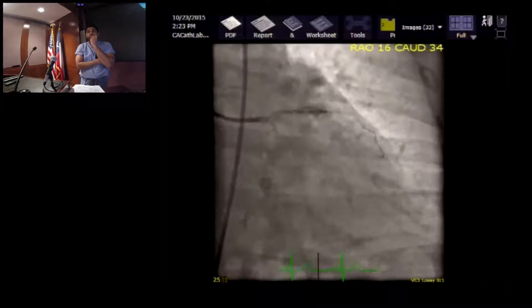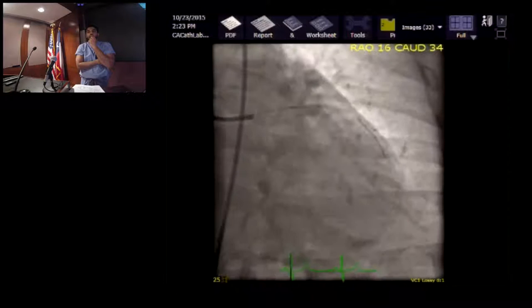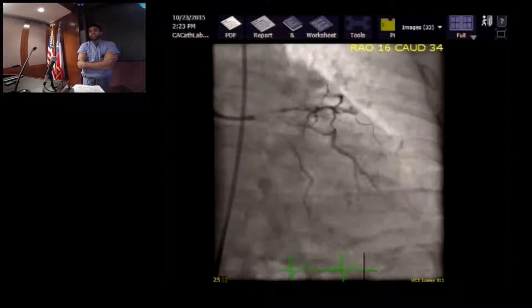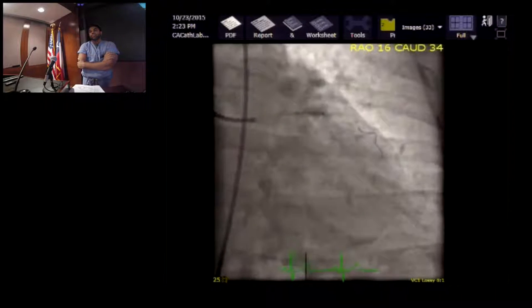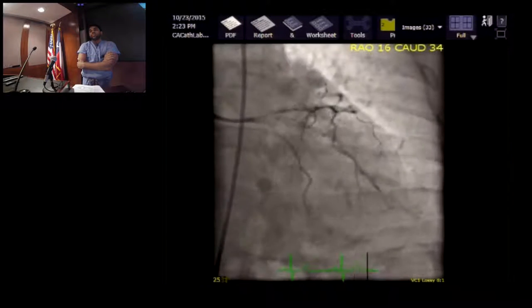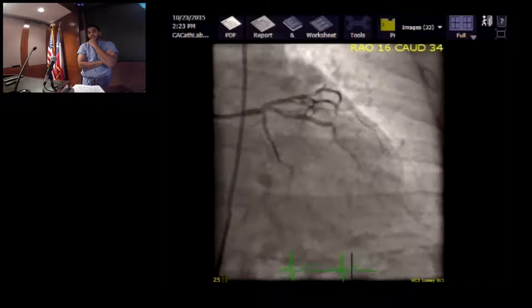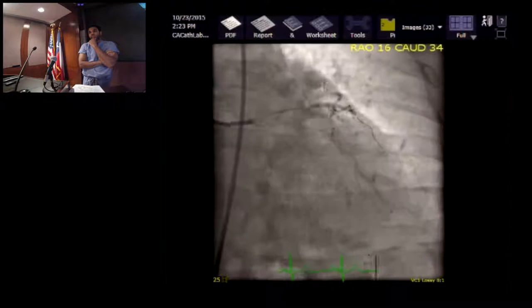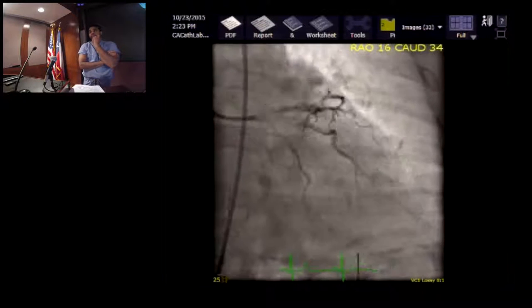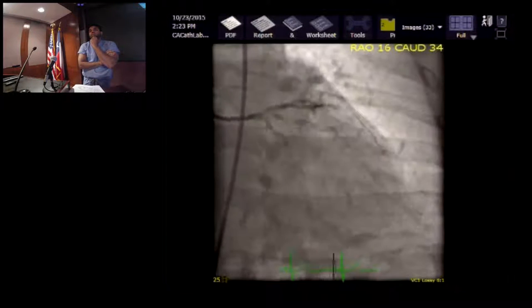Yeah, so we actually did that. Unfortunately, we didn't spend enough time doing a washout of the adenosine infusion. What Josh is talking about is you can selectively cross a lesion into the LAD and the diagonal, do those FFRs, and then bring the wire just beyond the LAD ostial lesion but proximal to those distal lesions, and do a third FFR. We tried doing that, except we didn't wait enough for the adenosine washout. Why do you have to wait for the adenosine to wash out? To recalibrate, because you're still running 0.76, 0.73 on the wire, which is downstream. You can just put it back, and it has to be recalibrated.